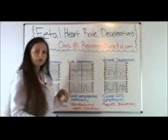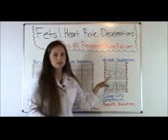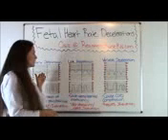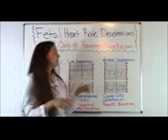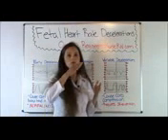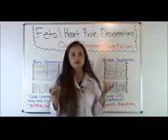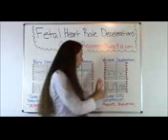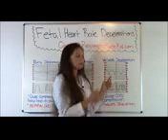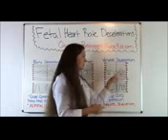Now, variable decelerations. This looks a lot different than the other ones. Do you not agree? Because look, it's not uniform. Late and early were uniform looking, so that's another key to how you know if it will be variable. The baby's heart rate will respond at different times because what's happening is that there's cord compression. So we're looking at mom's contractions, she's contracting, and baby's heart rate is just all over the place. It dips down, she contracts, it goes up, and it's just everywhere.